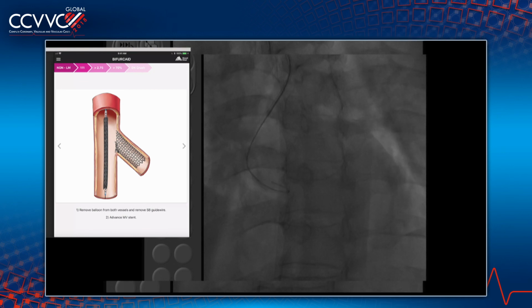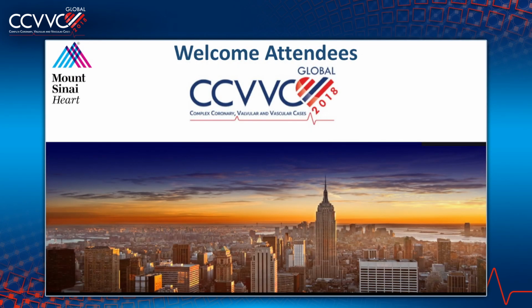This wouldn't have happened if this was femoral. I know, that's what Dr. Kini is saying. I am telling you, you're reading my mind. And then mini crush, 7 French mini crush.